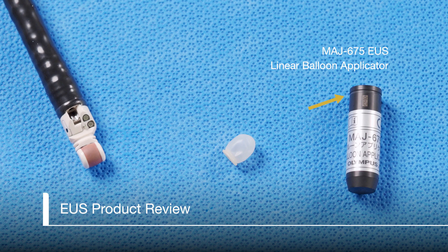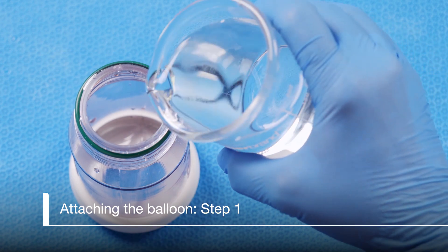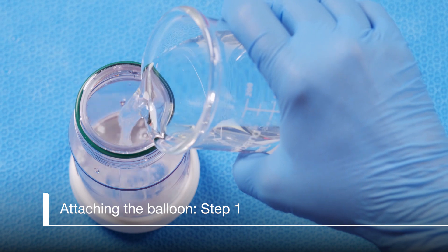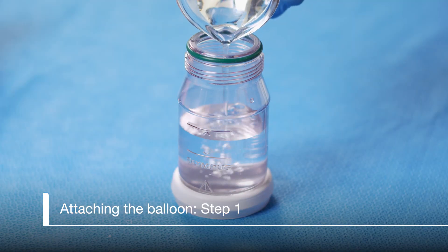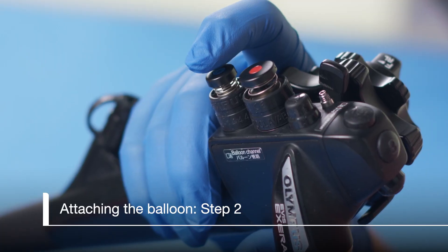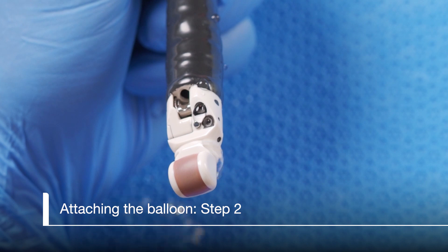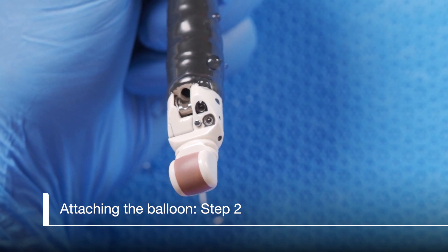Note the groove for the ring on the balloon. Now that we have all the parts assembled, let's begin the process of getting the balloon on the scope. First, fill the water bottle with water to the fill line only. Do not overfill. Depress the air water valve completely until the water flows from the balloon water supply port to eliminate air from the channel. Do not depress the suction valve.